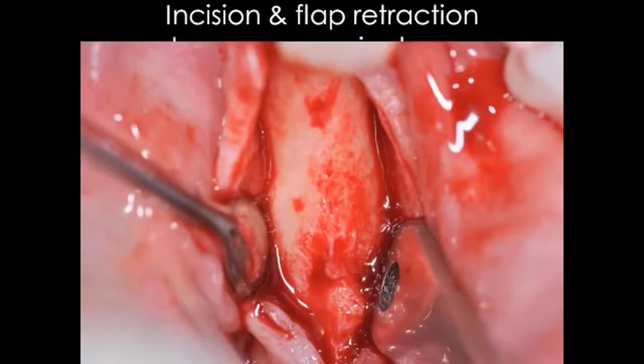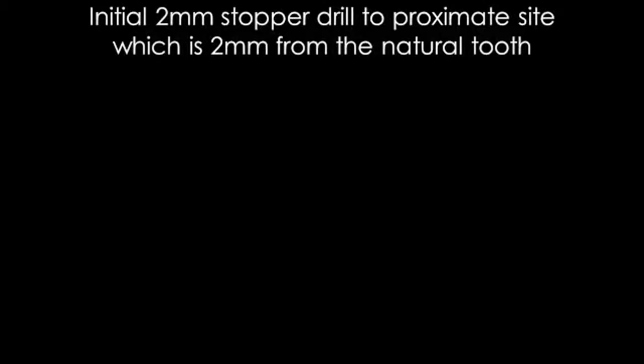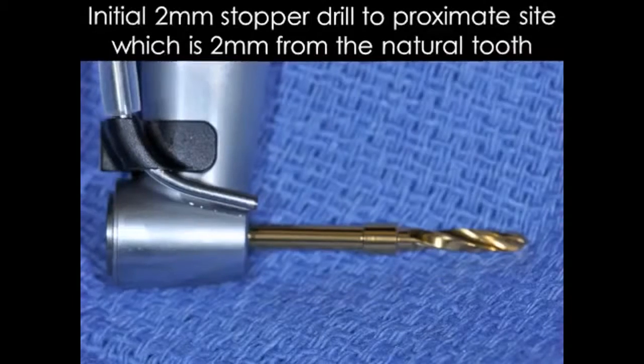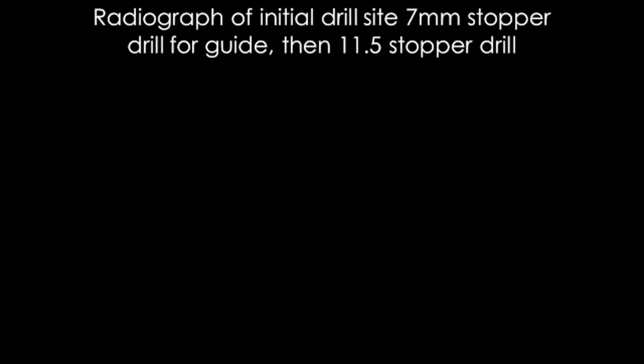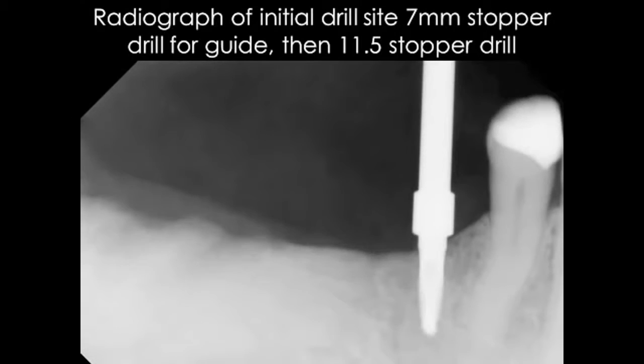Here we show the incision and flap of the particular area where we're going to be utilizing these implants. You can see clearly the nice ridge. We've already debrided the area of granulation tissue. And now we're going to be initializing our drilling process. I like to utilize the 7 millimeter stopper drill first, then take a digital x-ray to have a really nice marker of the area. Your 7 millimeter drill is not going to be compromising any anatomical structures, so we can utilize the 7 millimeter stopper drill first, take an x-ray, and then proceed from there.